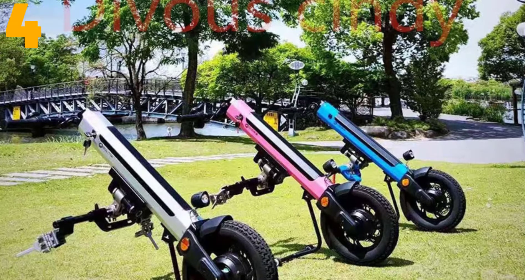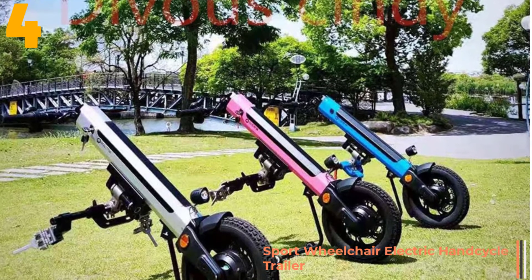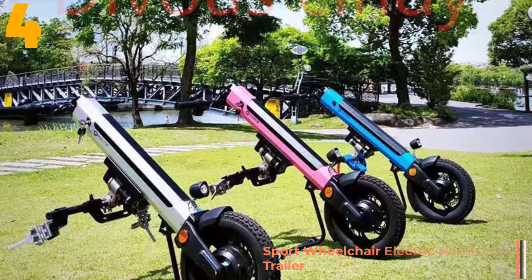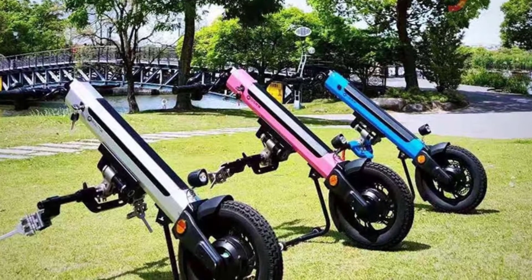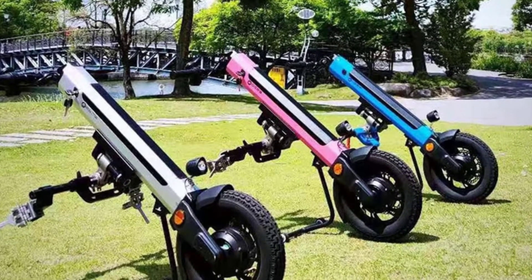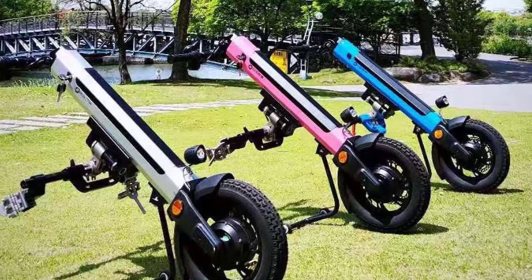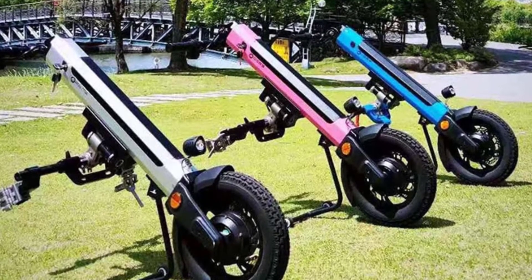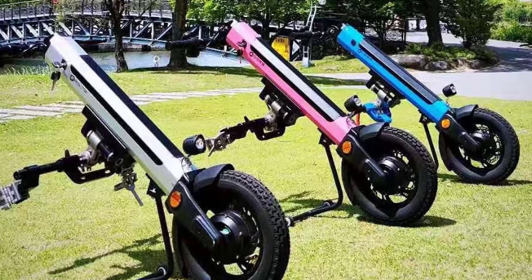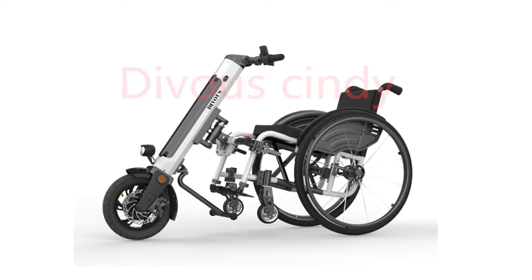Item number 4 is the Sport Wheelchair Electric Handcycle Trailer Head. Specifications: Brand name: Divous. Origin: China Mainland. Motor: 350 watts. Battery: 36V. Speed: 25 km/h. Net weight: 14.1 kg. Tires: 12 inches. Endurance: 50 to 60 km. Maximum climbing angle: 10 degrees.